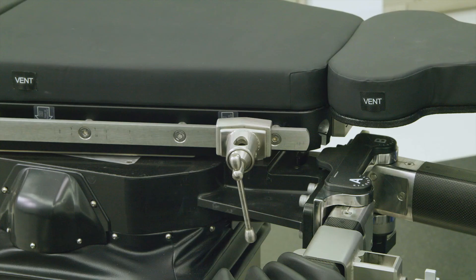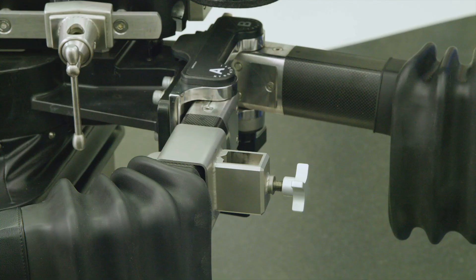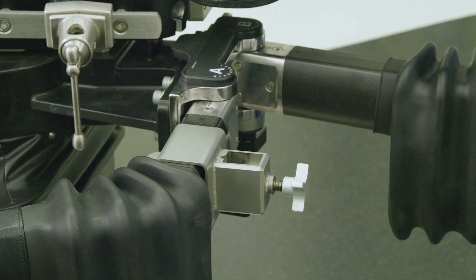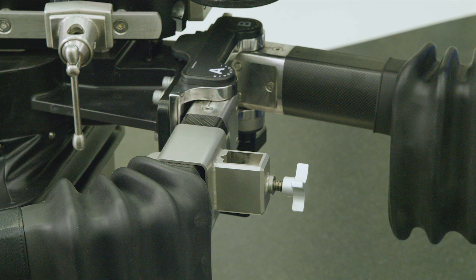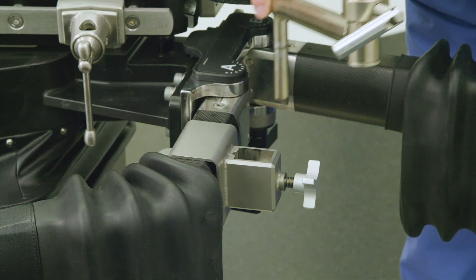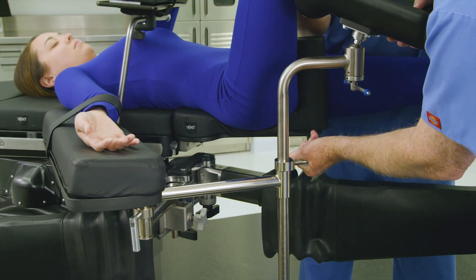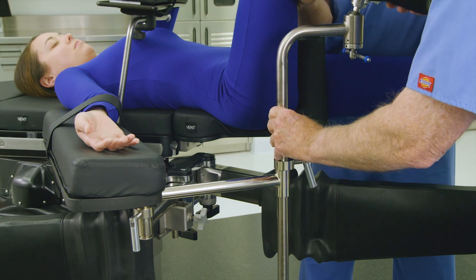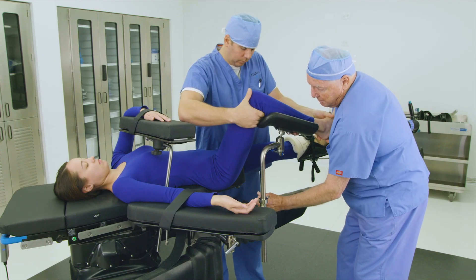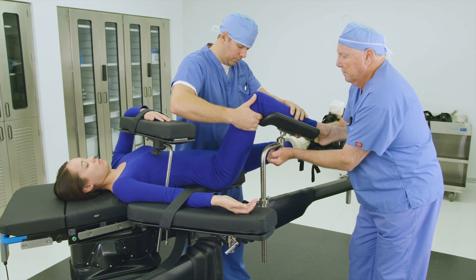Place the socket clamp on the tabletop side rail of the table on the non-operative side. Alternatively, place the spar clamp on the short section of the spar on the non-operative side and tighten down the handle to secure. Place the socket post in the socket clamp or the spar clamp and tighten down the respective handle to secure. Use the adjustable joints of the articulating universal leg holder to position the device appropriately for the patient's non-operative leg. Ensure all connections are secured before placing the patient leg in the holder.